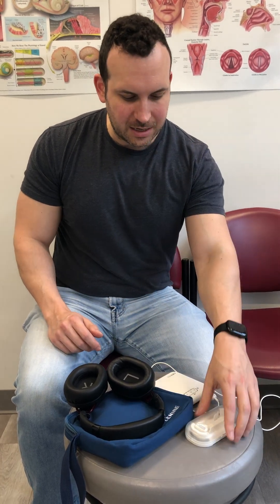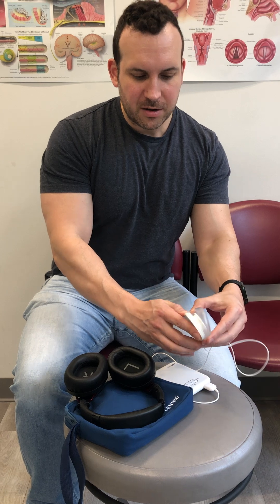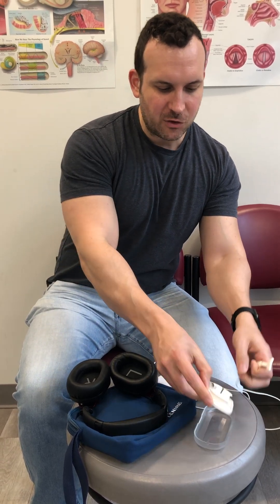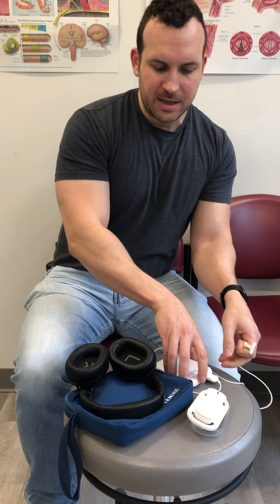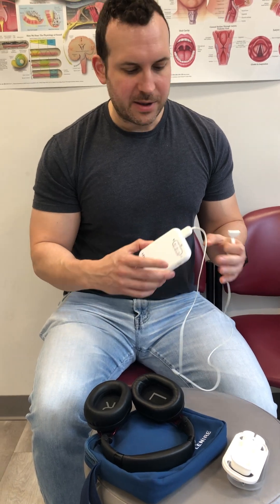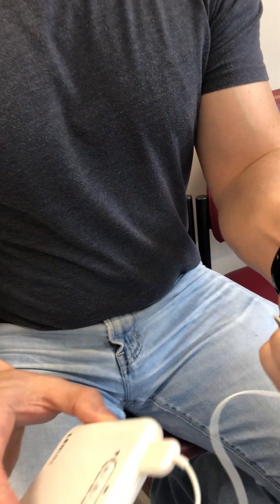So it's really like a three-part system. You have the main controller that has the battery in it and has all the actual software loaded into it — that's this little handheld device. Then you have a tongue piece that sends small electrical impulses to your tongue. Can we take a closer look at both pieces?